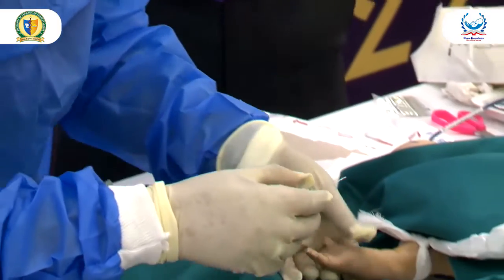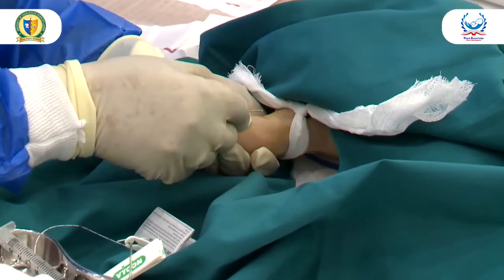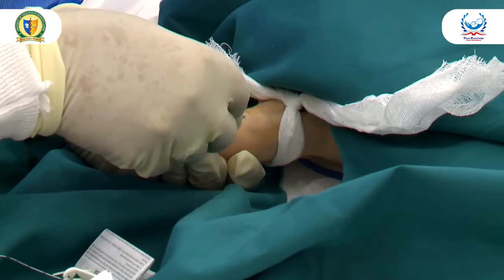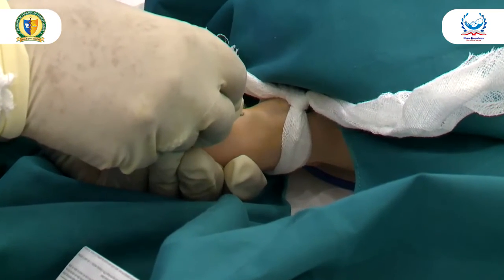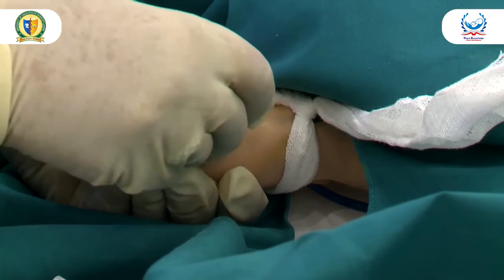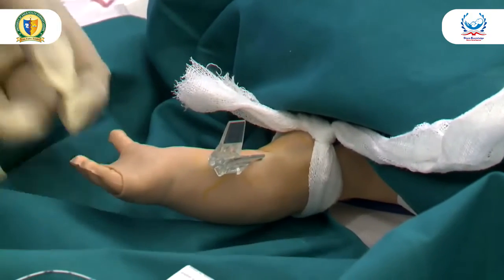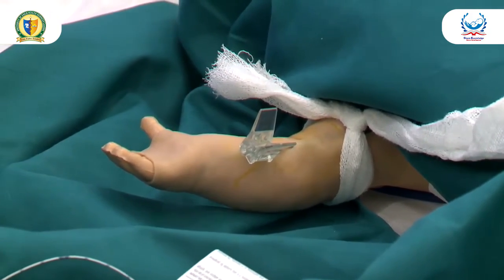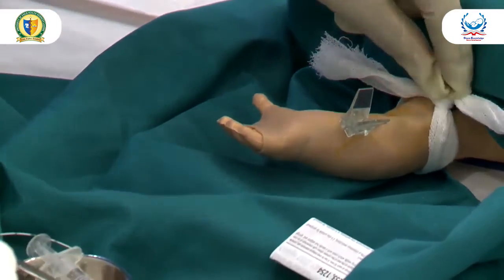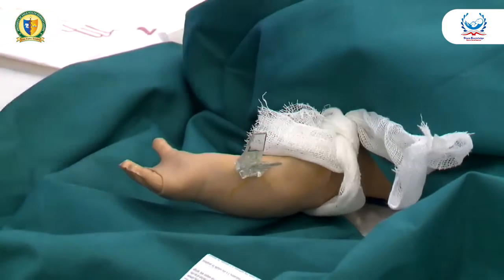So we are about to prick the identified site. It will be a fine single prick, and we will observe some blood coming out of the inserted cannula. As soon as we see the blood coming out of the cannula, we will loosen the tourniquet and start inserting our catheter to the target desired length.